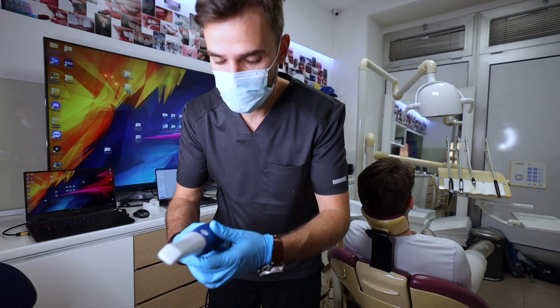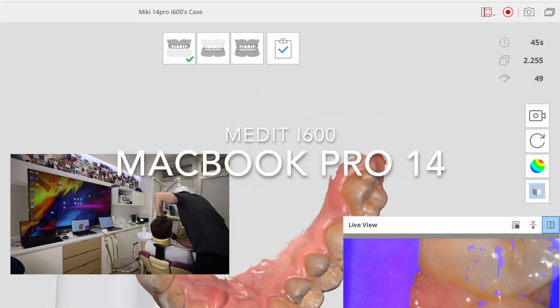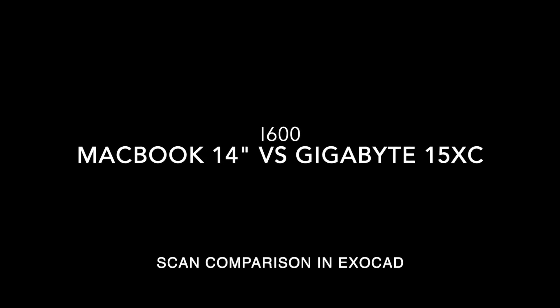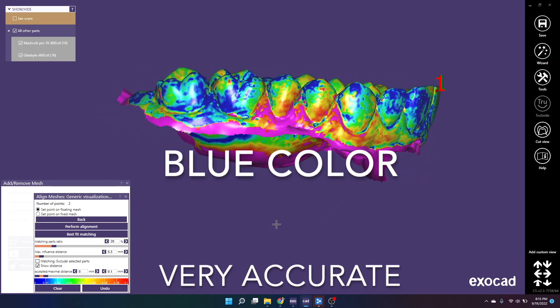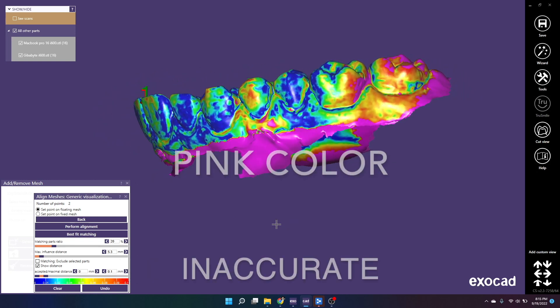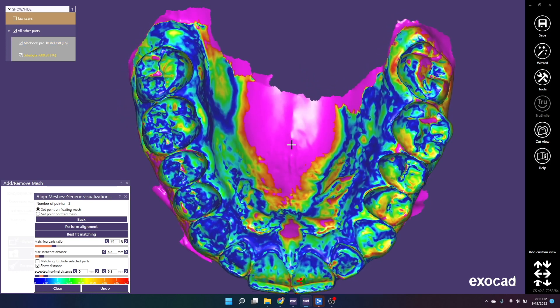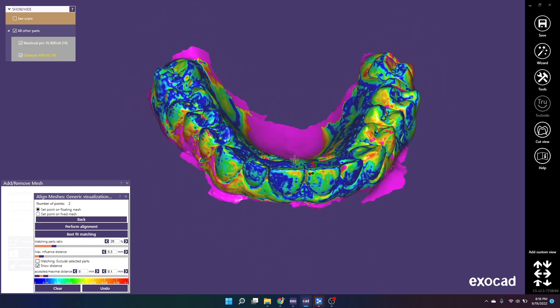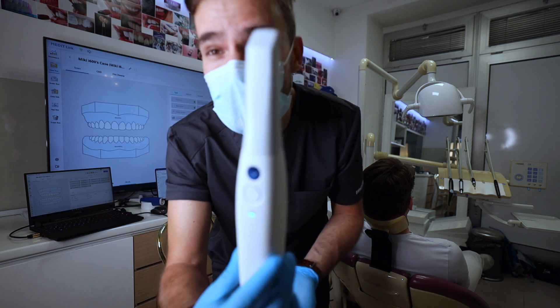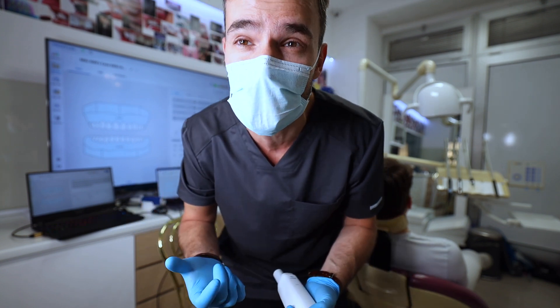Now we'll start scanning with the i600 on the MacBook Pro 14-inch, which has a slightly better performing processor — 10 cores versus the base model's 8 cores.